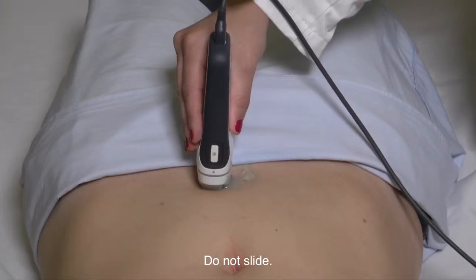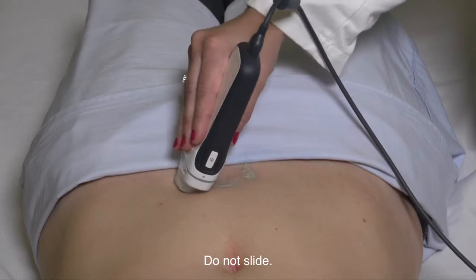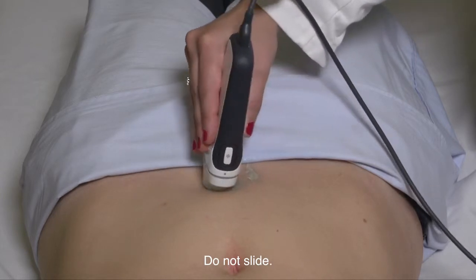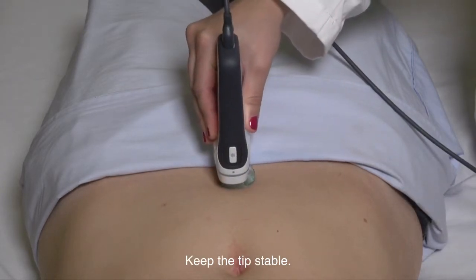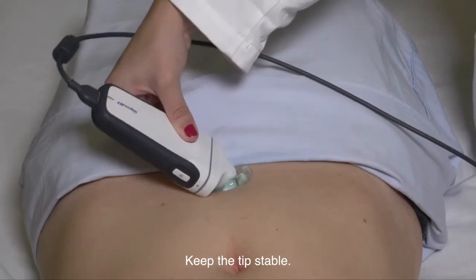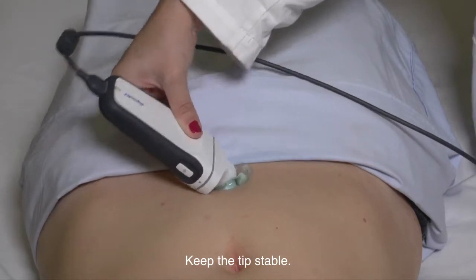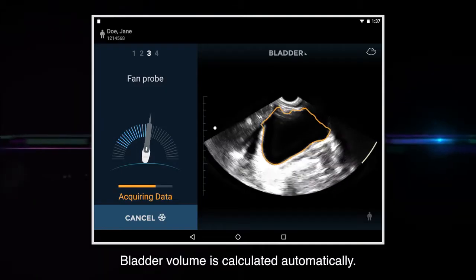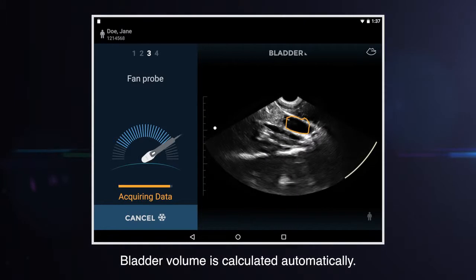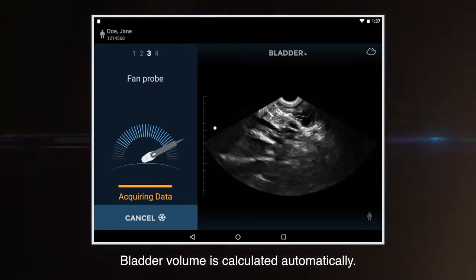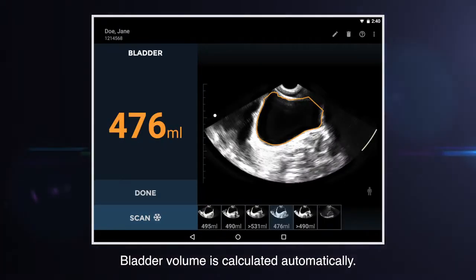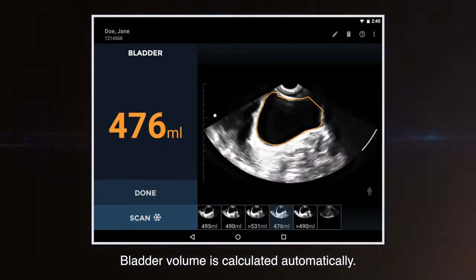Do not slide the probe as you gather the bladder data. It is important the tip of the probe is stable while data is acquired. At the completion of the acquisition, the system will automatically stop scanning and display the measured volume.